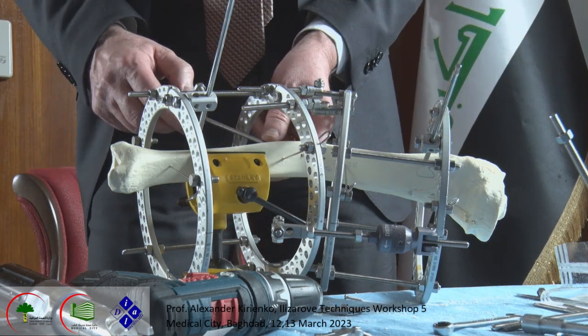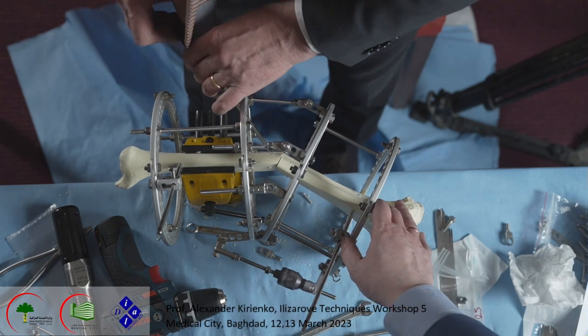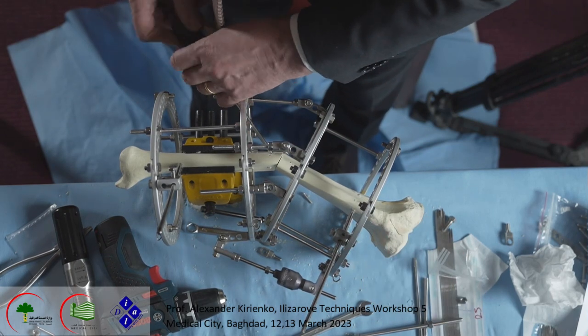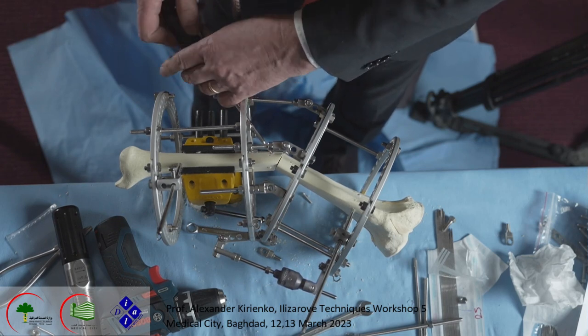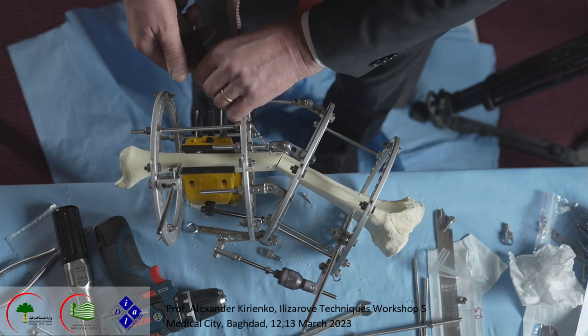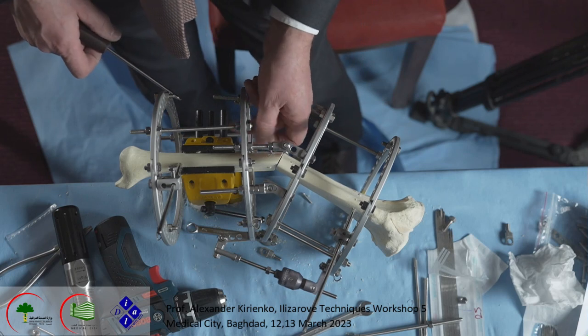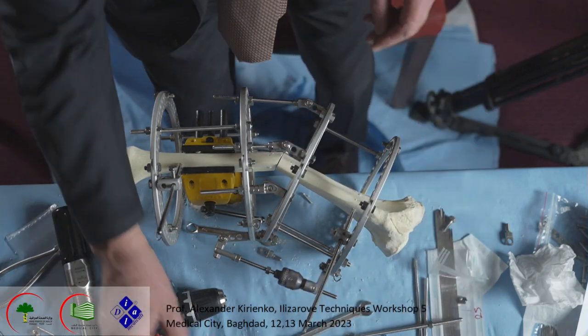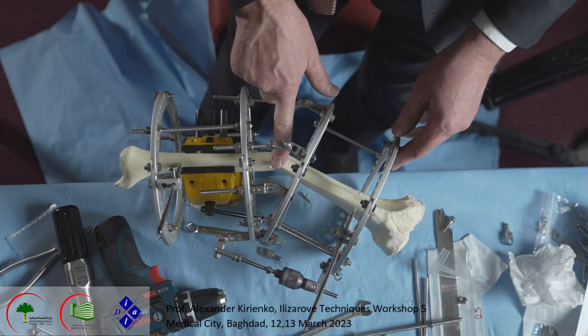We have the screw that fixes the fracture, interfragmental screw. Remove this. Okay. And now our osteotomy is free.